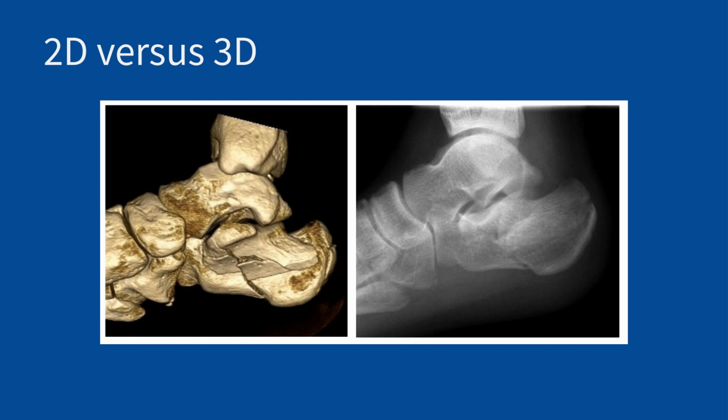You can acquire images either 2D or 3D. So most of the time, 3D images are generated from CT, but it is actually possible to generate 3D from fluoroscopy images if you acquire multiple planes. And we do that occasionally in interventional radiology, when we want to look at a typically hepatic lesion, not something I believe you will be using in podiatry, but still an interesting technique.